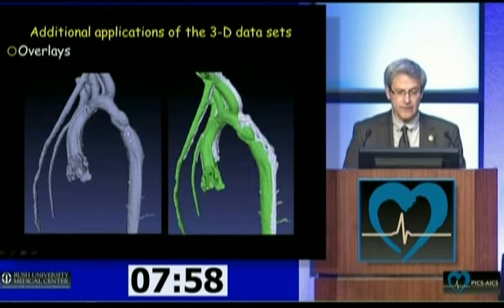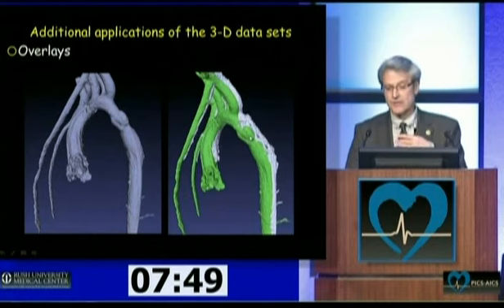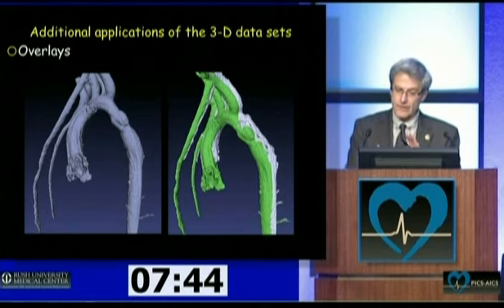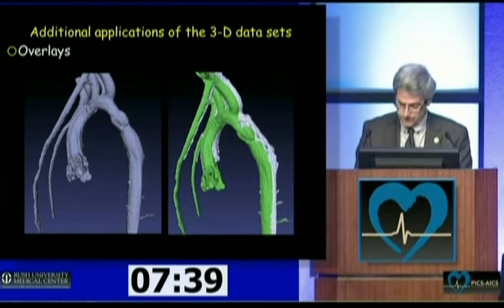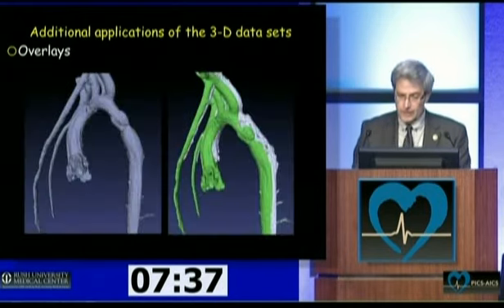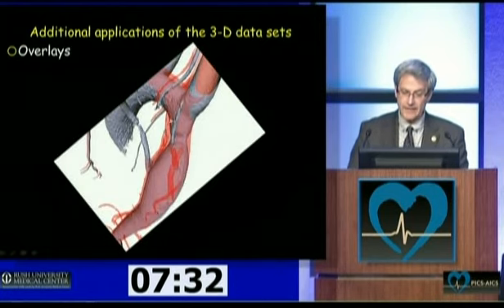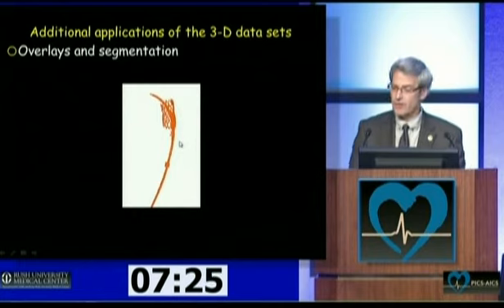When you overlay, you can understand how, for example, this patient who had an aneurysm, who was stented, how the aneurysm is interacting with the stent structures. And because when you get the acquisition the registry is exactly the same, because the patient doesn't move, you can either overlay like this, or you can overlay like that, so you can get an idea of the changes in topology for some of the procedures you're doing. Again, this is just an example of stenting.